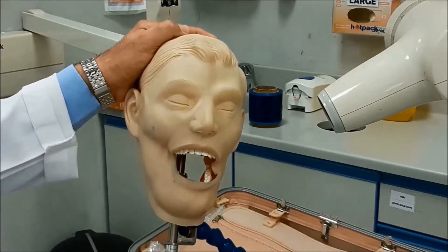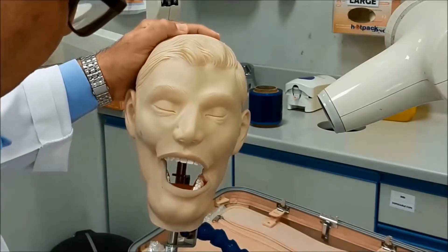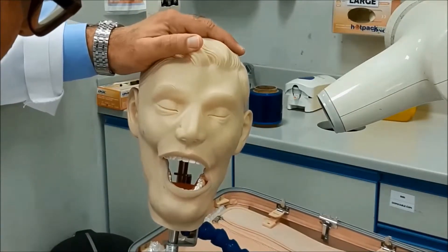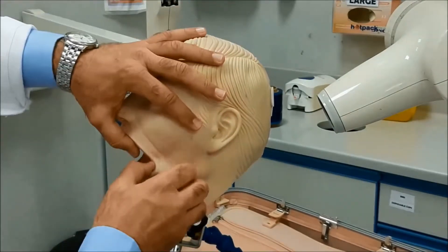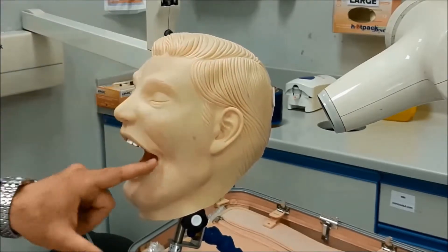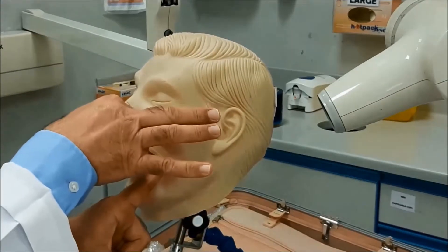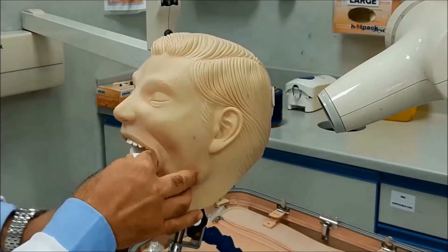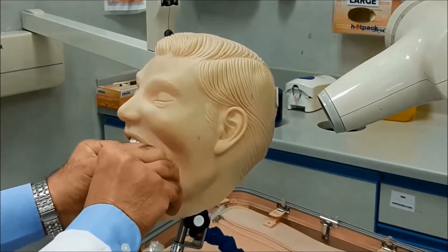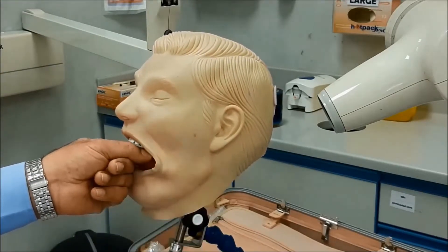The second molar should be biting on the groove or on the block. Stabilize the head, ask the patient to open wide, retract the cheek, insert the block with the film, and extend it all the way back so that the second molar will be biting. From the front, the second molar should be biting on the block.